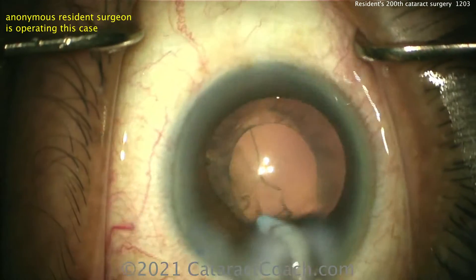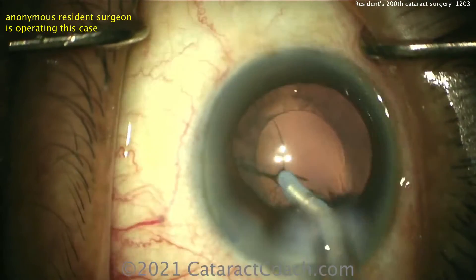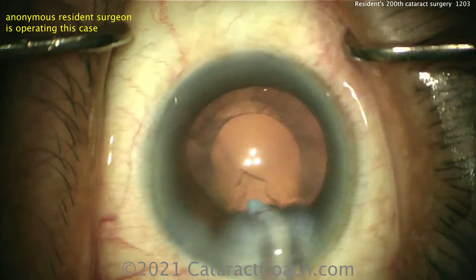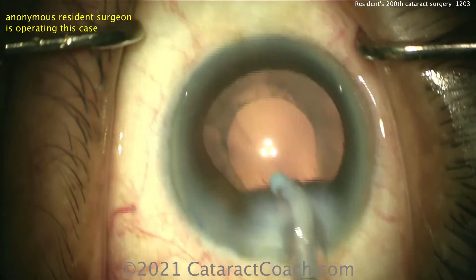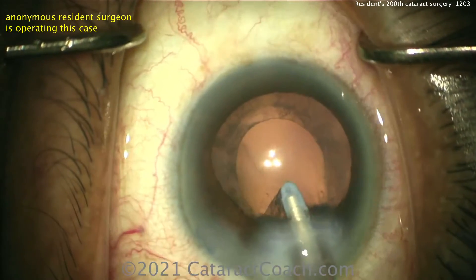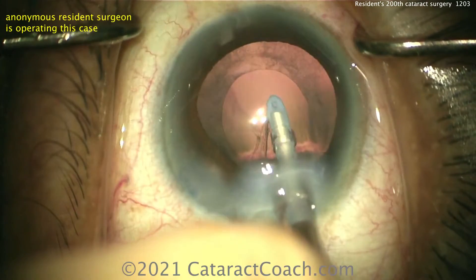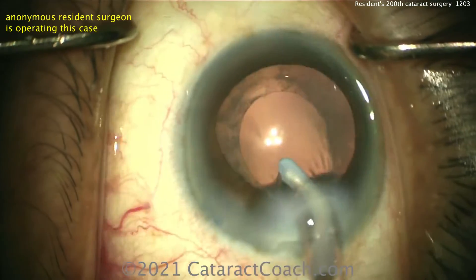You know, we're in July now of the academic year — this is a big challenge. July and August are the biggest challenge of the academic year, because this is where we are really getting our hands wet and trying to climb up that steep learning curve. Good job.